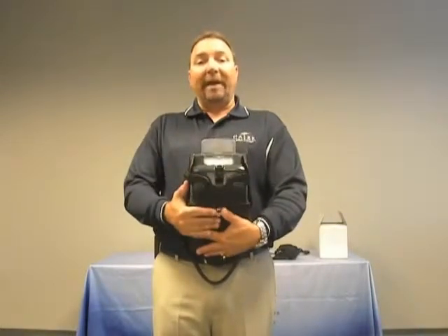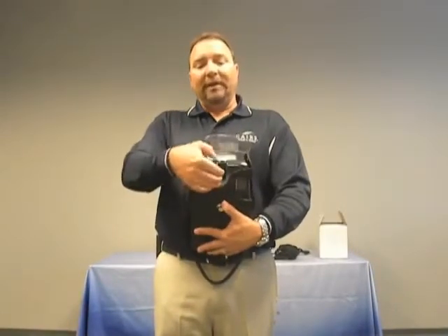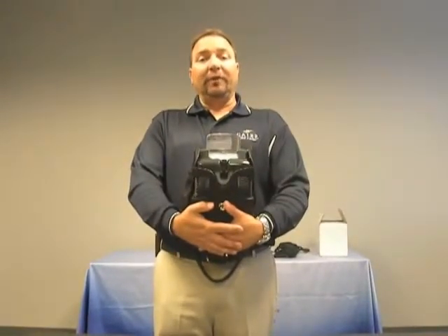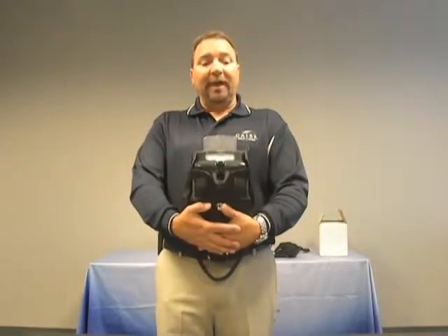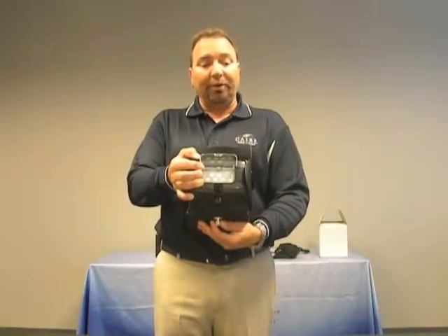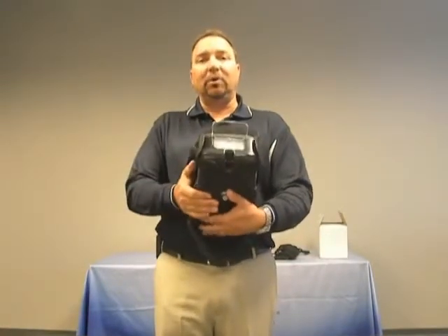In addition to the low battery alarms, we also have an apnea or cannula disconnect alarm. Should the patient be using the FreeStyle and they forget to turn it off, or the cannula is disconnected from the oxygen outlet, after a period of time, the FreeStyle 5 will provide an audible alarm, which is a continuous yellow light in the upper right-hand corner, along with a constant audible tone. This can be checked by making sure you have secure connections with the cannula tubing at the outlet.